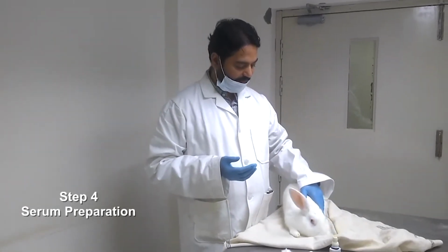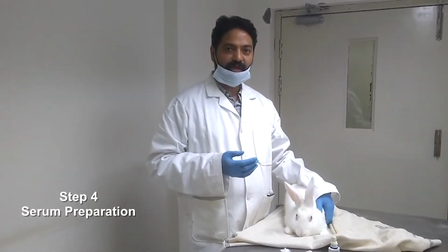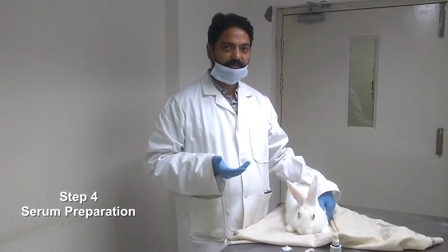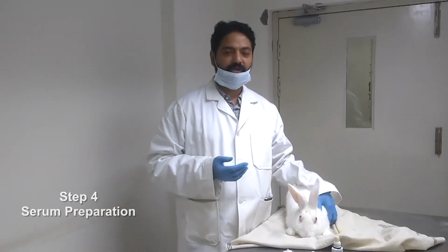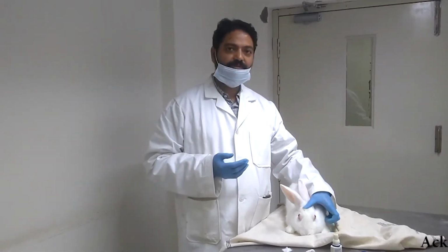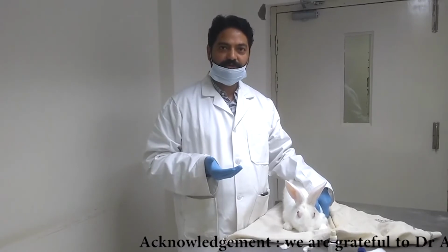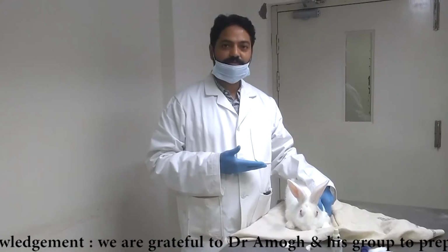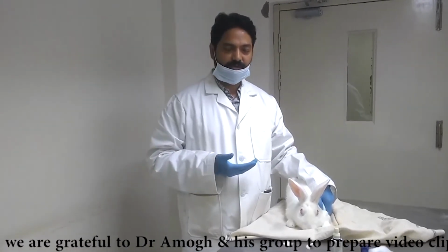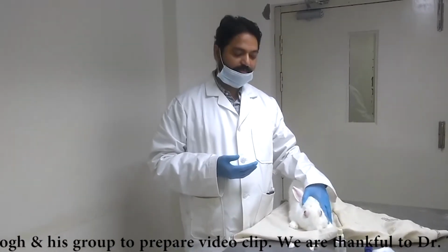Now you can see this whole of the animal, this animal is very relaxed. I think it has very little or negligible pain. This is very important when you handle the animal: in whatever procedure you go through, the animal should be ensured not to have pain. If you understand it is a painful procedure, you anesthetize it. Since this procedure is not painful, we have not taken that step. So this is a very important step to ensure that the animal has no pain.